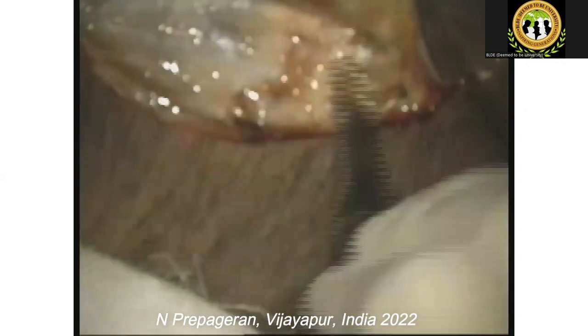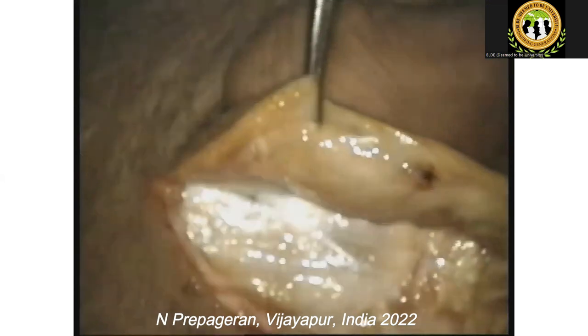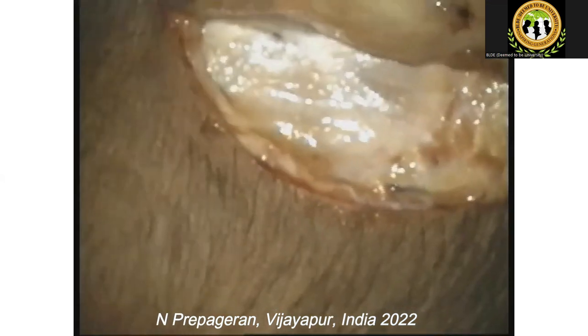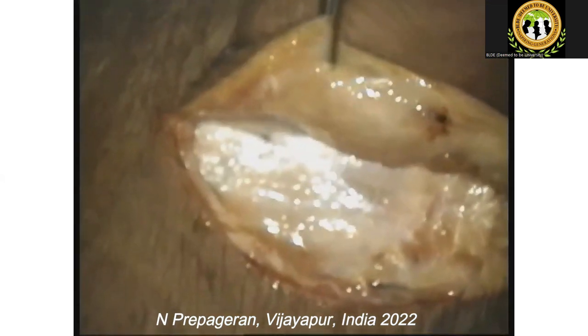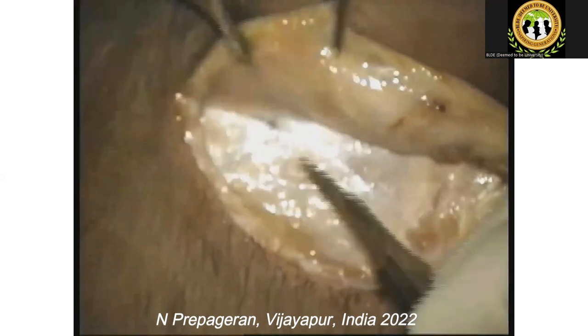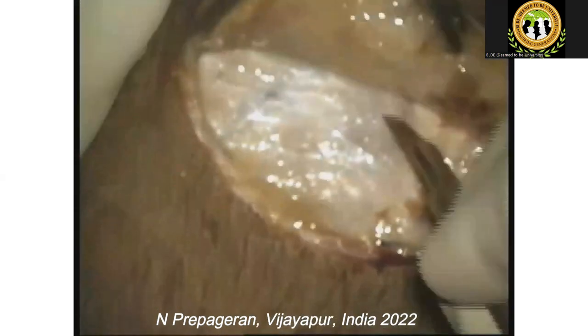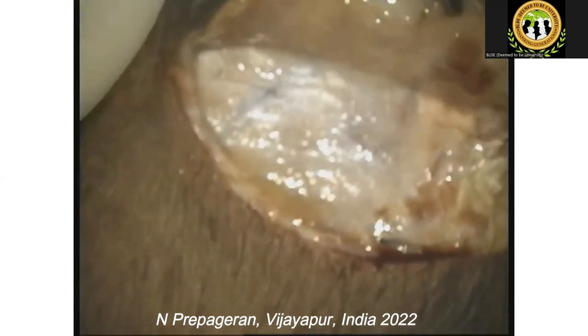That's the fascia. Is it clear on the screen? Okay, is it clear on the screen now? Yes, sir. So now we're going to dissect until we're able to see the fascia.